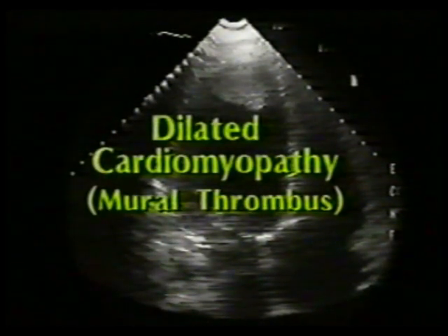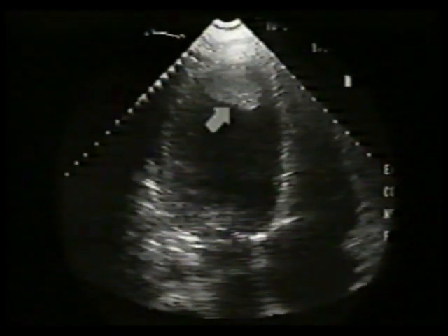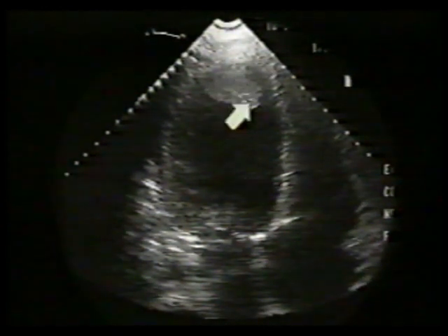Mural thrombus, with its potential for systemic embolization, is one of the most dreaded complications of dilated cardiomyopathy. If mural thrombus is recognized soon enough, embolism can be prevented by anticoagulant therapy. This is a huge apical thrombus in a 29-year-old male with idiopathic dilated cardiomyopathy.